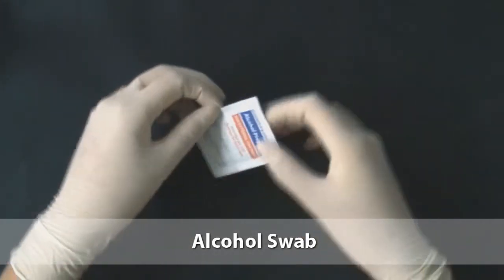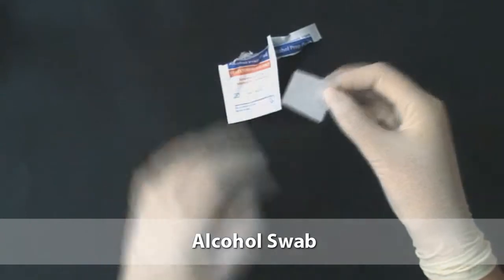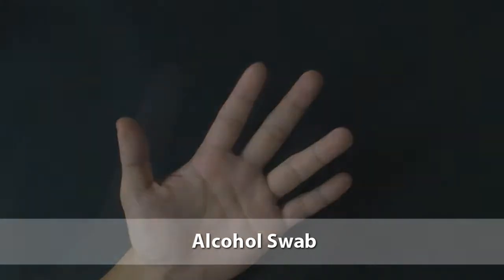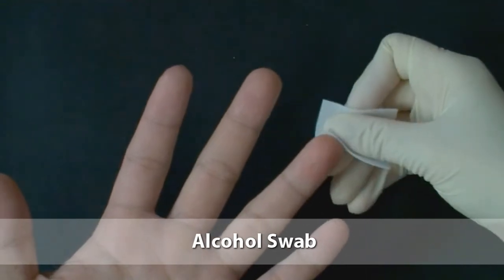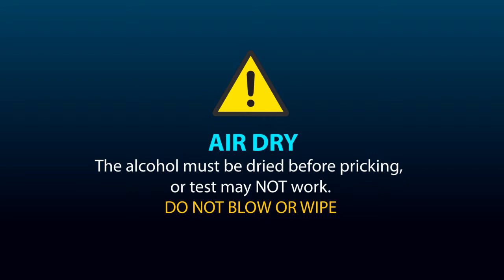Open the alcohol swab. Grasp the fourth finger of the patient's hand and clean the patient's finger with the alcohol swab thoroughly. After cleaning the finger, it must be allowed to air dry. Remember, the alcohol must be dried before pricking or the test may not work. Do not blow or wipe the finger when drying.